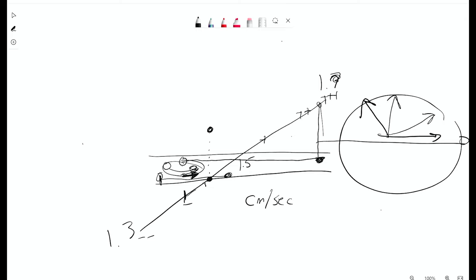So now what we can do here in the phase direction is say anything at zero, we're going to give a gray pixel to. Anything that's moved really far ahead, we're going to give a bright or a dark pixel. Let's say, for instance, I've decided anything that gets faster, I'm going to give a bright pixel. So this would be gray. This one would be bright gray. This one would be pretty decently bright. And this one would be bright. You see what I mean? So now we can see inside of a vessel, and the vessel will be bright based off of its phase.